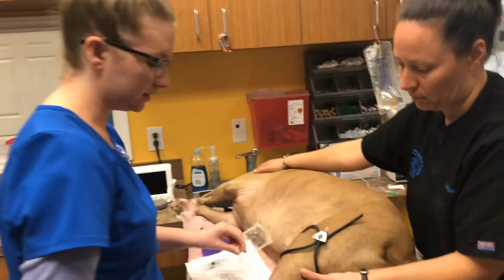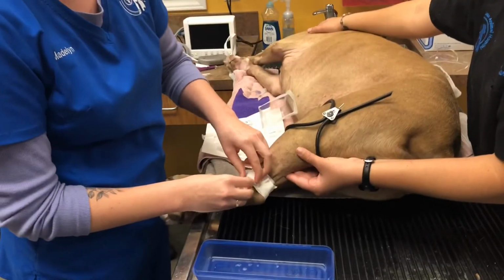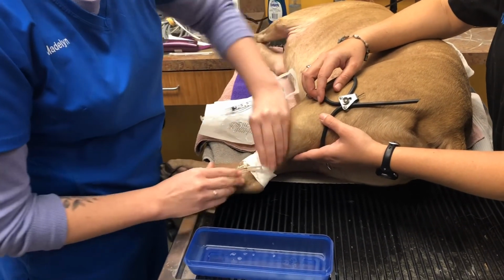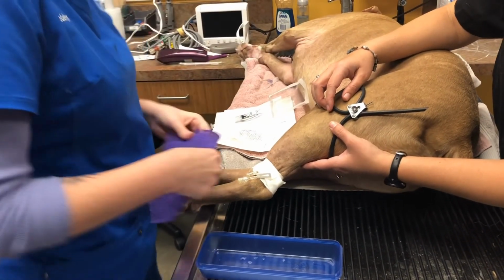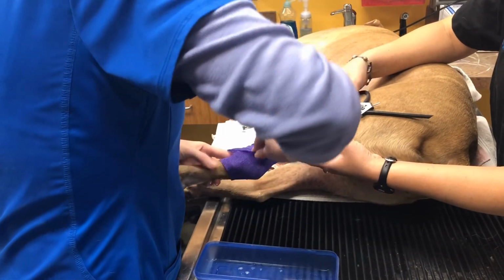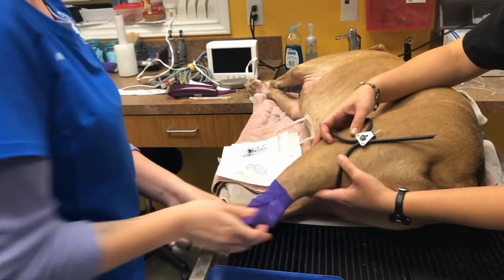I can flush it through. It's patent, so I'll take my flush off. And then apply my male adapter plug. Then close off our line until it's ready to use. We'll also cover it with a piece of vet wrap until it's ready to keep it as clean as we can. Okay. And that's it.